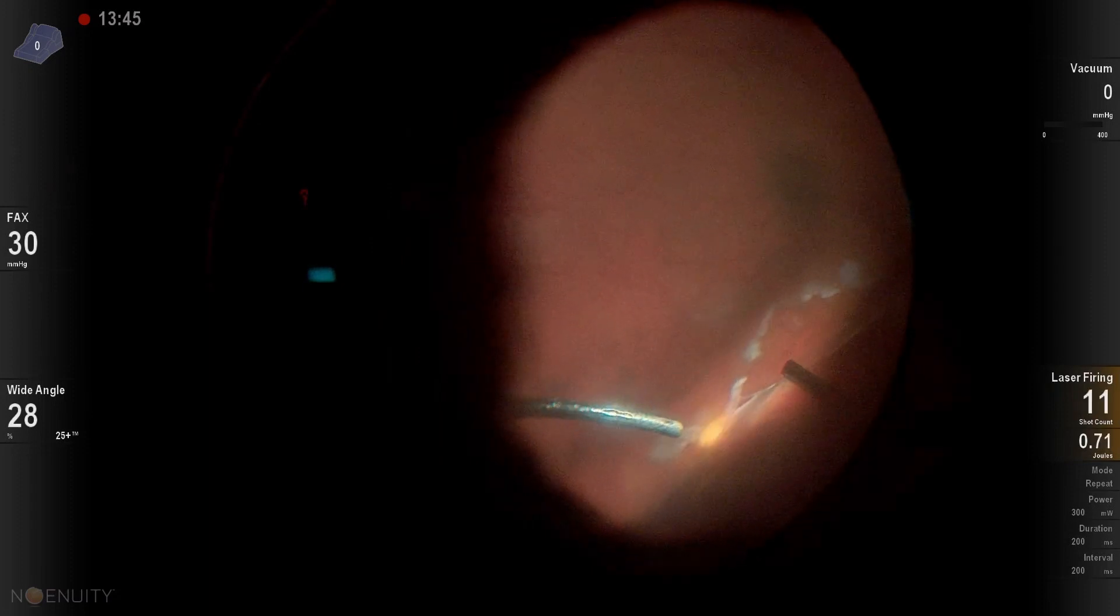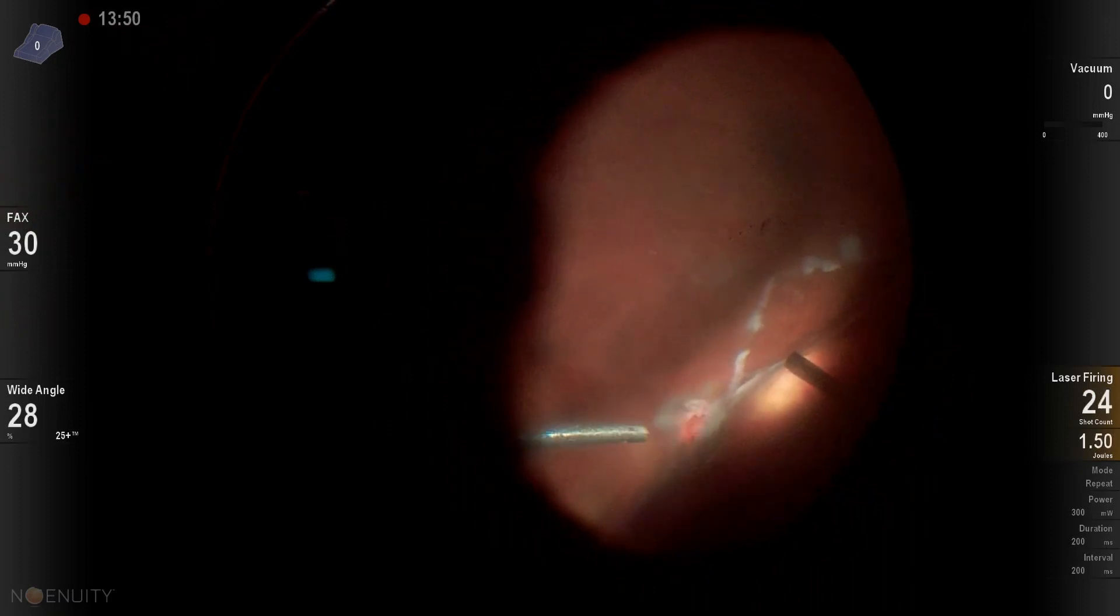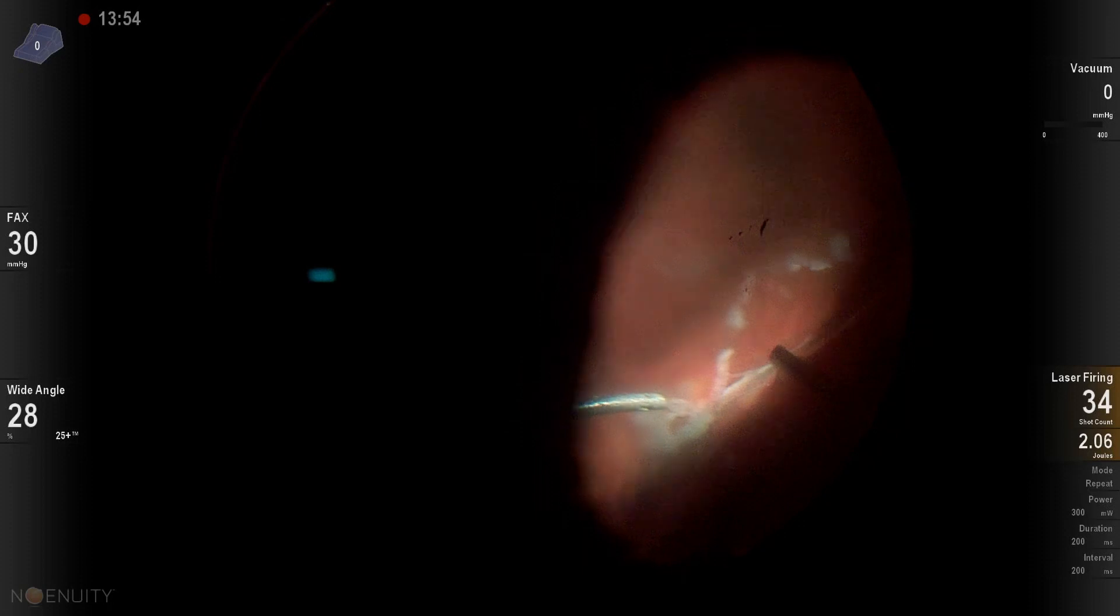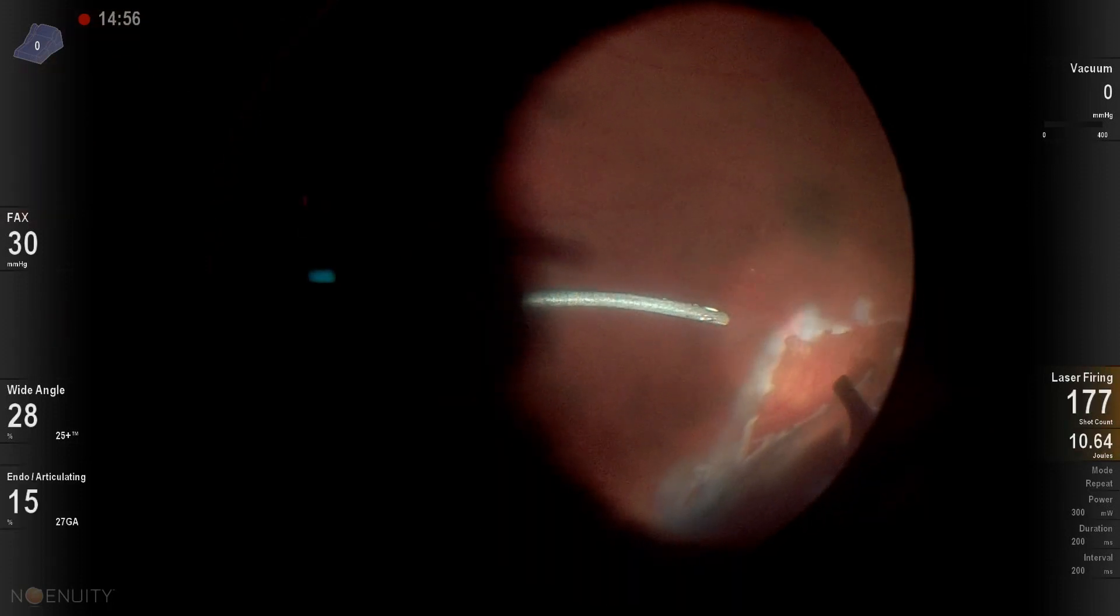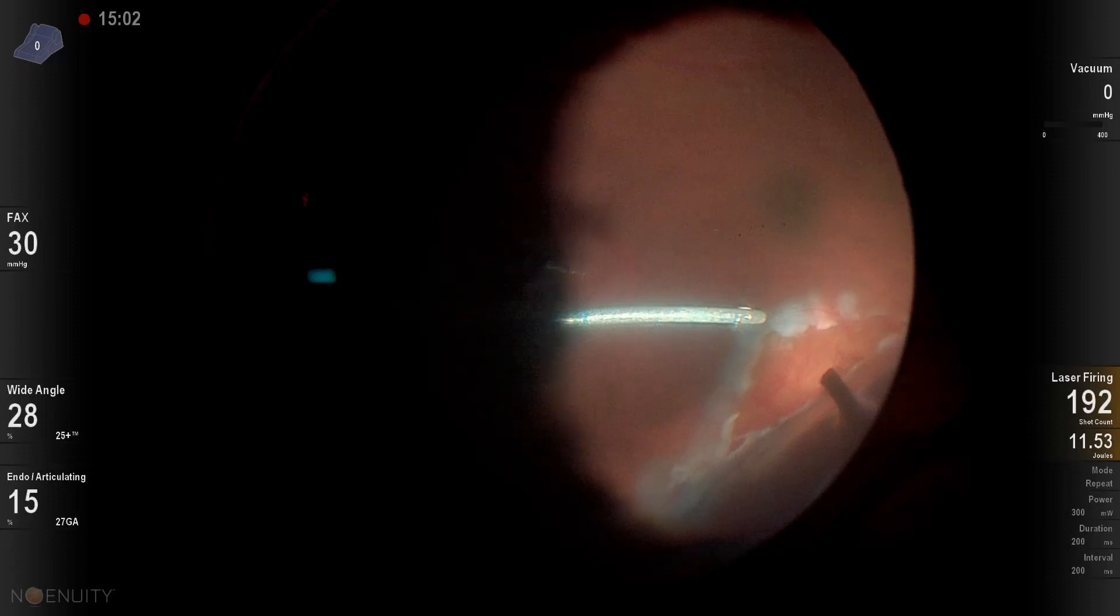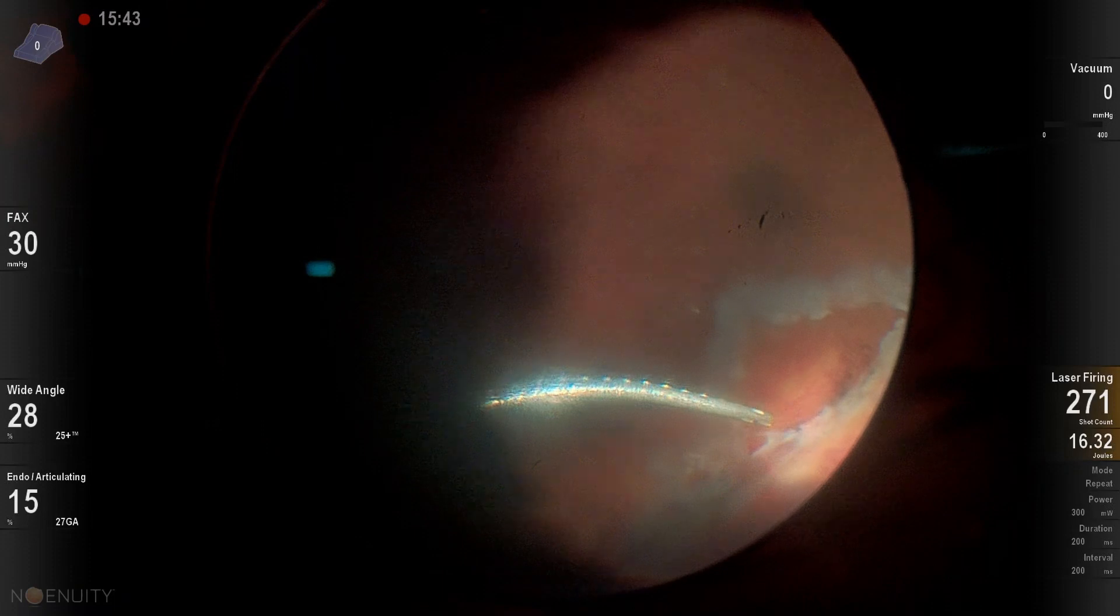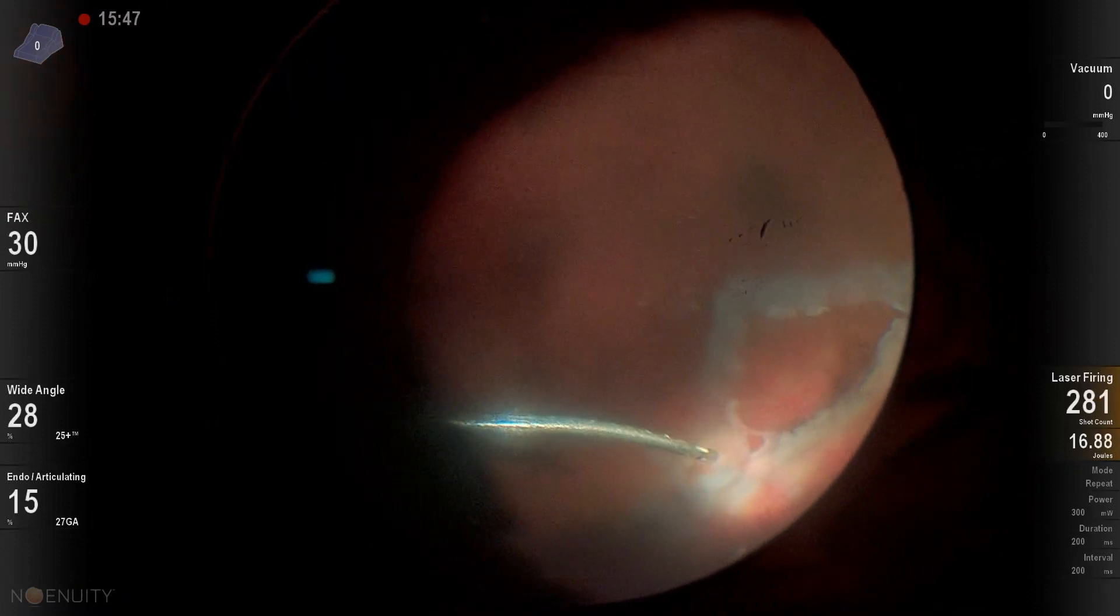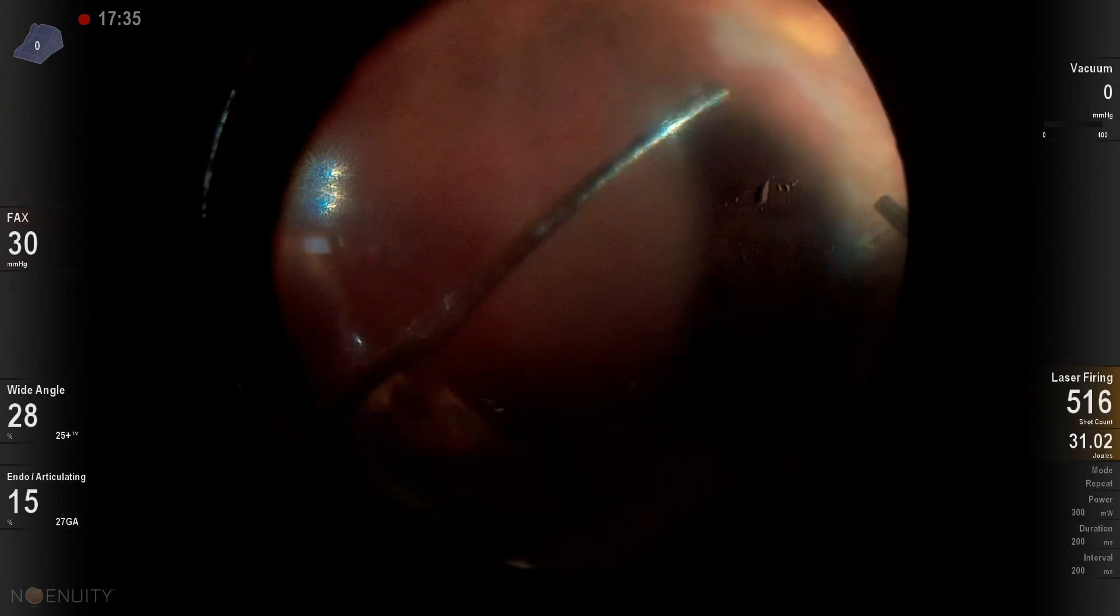And then we're going to do some endolaser. And in this case, we're going to laser anything suspicious. We're going to laser anterior edges and posterior edges of the break all over that temporal area. And then I'll usually laser a clock hour or two on either side of all of the pathology. Nothing was going on nasally, so we didn't have to add any laser there. You can see lasering anterior here where the vitreous is still attached there, but we shaved it down once again with vitrectomy and vitrectomy under air.